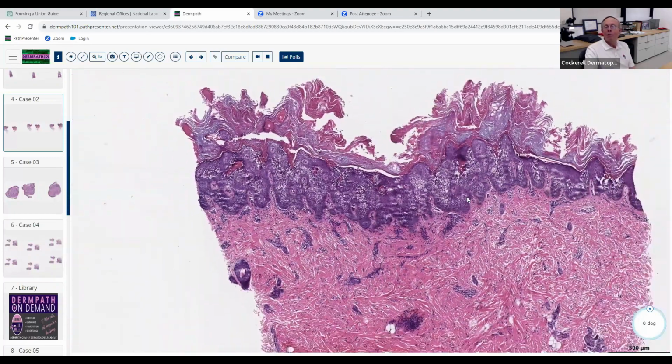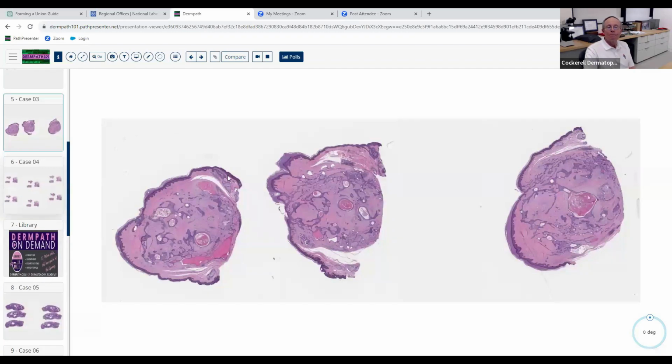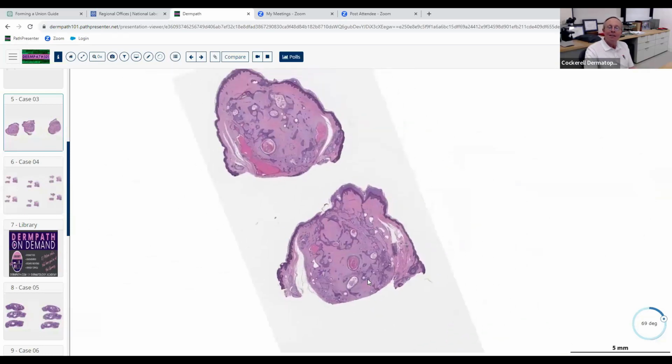So that's a good example of epidermolytic hyperkeratosis, and it's an epidermal reaction pattern, and you will confront that on the board. So it's kind of good news, bad news. Good news is you know what to expect because it's coming. Winter is coming. Well, that's coming.